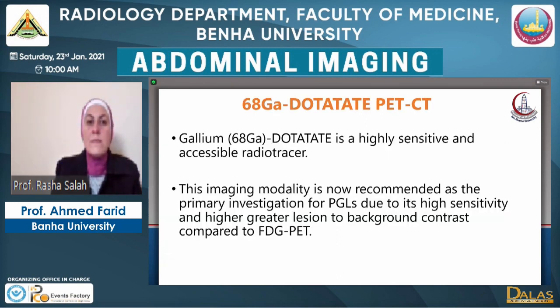Then comes the recent imaging tool, which is the gallium dotatate PET-CT. Gallium dotatate PET-CT is characterized for the neuroendocrine tumors with somatostatin receptors. It is targeted for this particular set of tumors, not for all tumors, and it doesn't depend on the metabolic activity of the tumor.